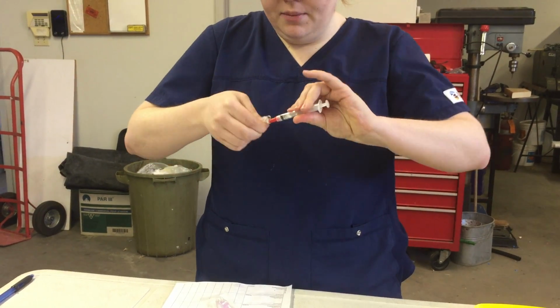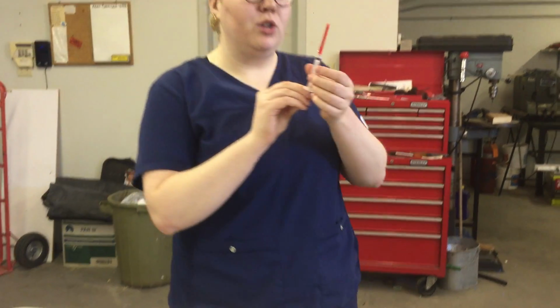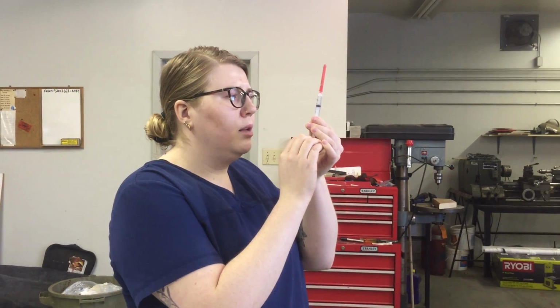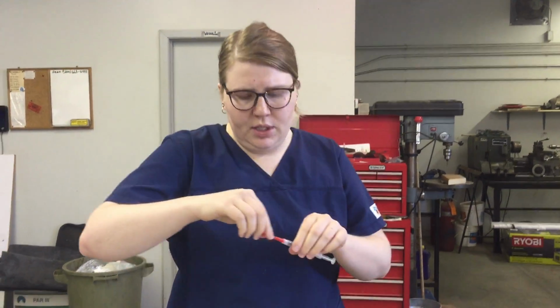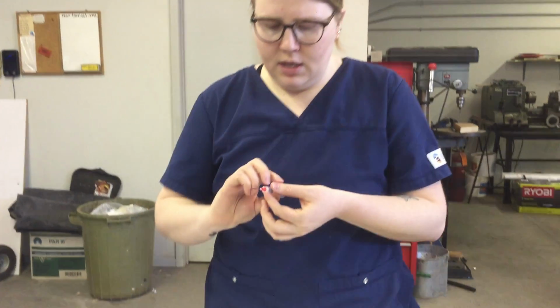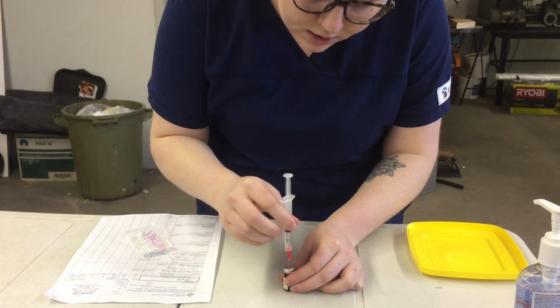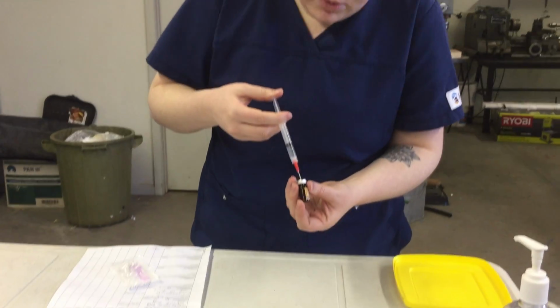And we're going to attach it here. So once I've done that, I'm just going to draw back the right amount of air to set up my pressure system. So we're going to draw back a little more than 1 ml. I'm going to take the cap off of this and I'm going to inject the air.